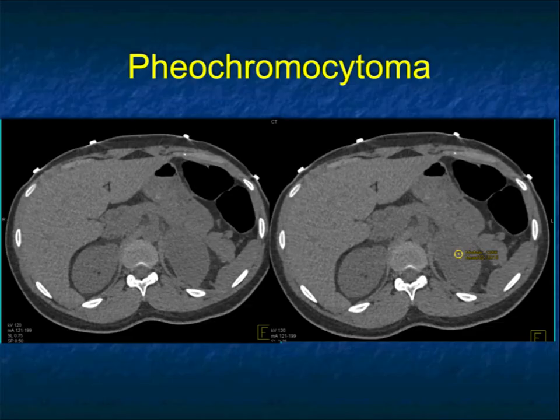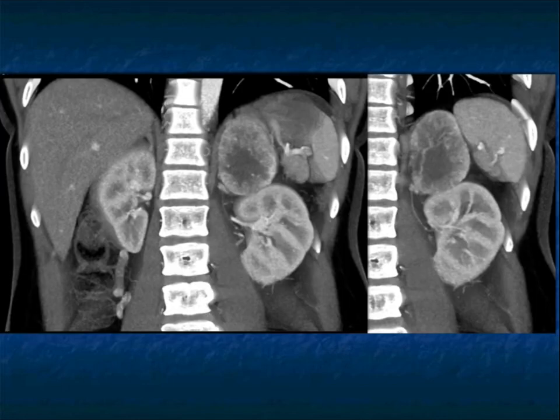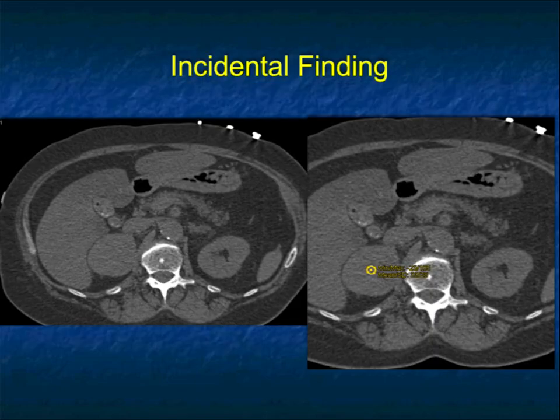Another example — look at this patient's left adrenal on the non-contrast scan. When you give IV contrast, unlike the last case where the adrenal was very diffusely vascular, here you see more central necrosis. Could this be a primary adrenal carcinoma? Could this be a met? This is just to show you that pheos are not always purely vascular. Here it is on the reconstruction view, nicely sitting by the upper pole of the left kidney.